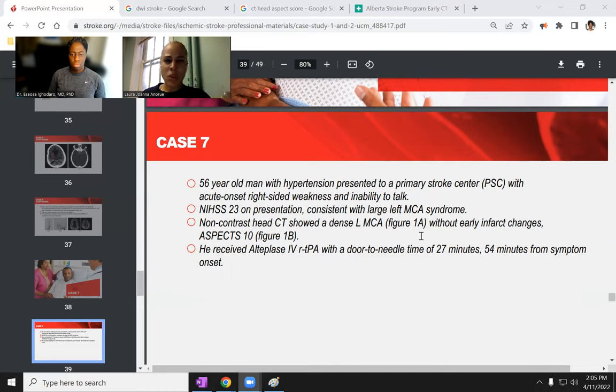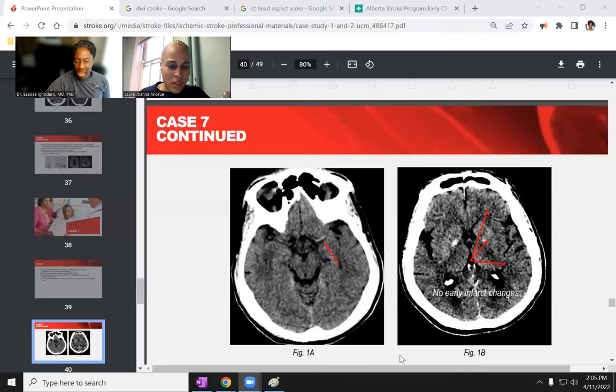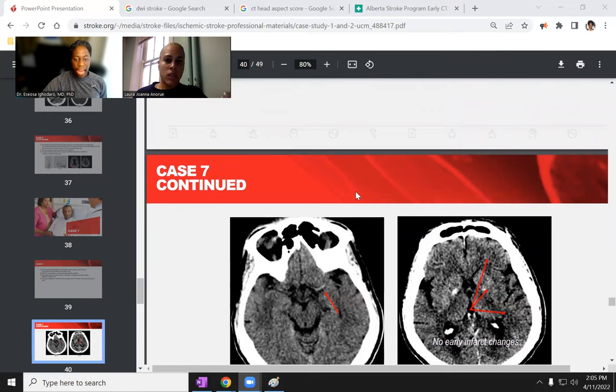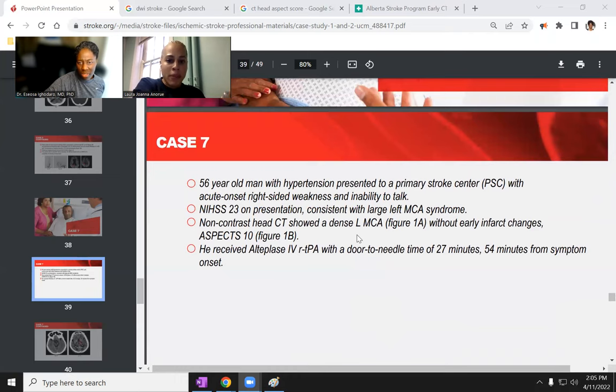When they say dense, is that what you were talking about with the dark area? Like, what is that? Hyperdense MCA sign, where the MCA is highlighted. Let's see. You see that? So they call this the hyperdense MCA sign. It can correlate with a clot in the MCA. You know how it looks brighter than normal? It does. And it's not symmetrical to the right hemisphere. Exactly. So sometimes if you have a really thick clot in the blood vessel, it can look hyperdense on imaging. And it fits with his symptoms. Yeah.